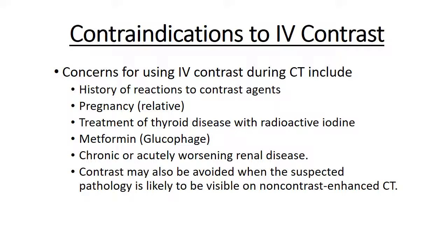Contrast may also be avoided when a suspected pathology is likely to be visible on non-contrast enhanced CT. And, basically, if you can do it without contrast, then don't subject the patient to IV dye, which does have risk, including nephrotoxicity. And examples of that would be CT stone protocol.